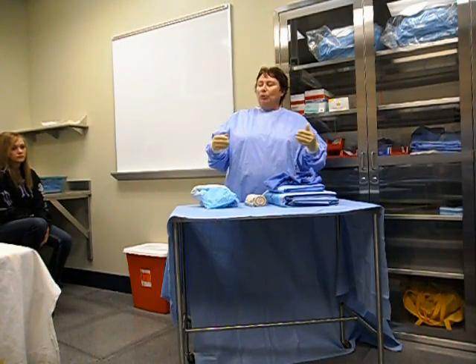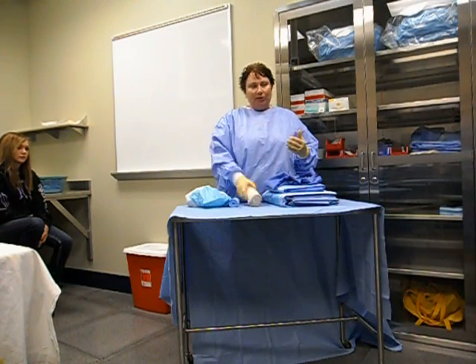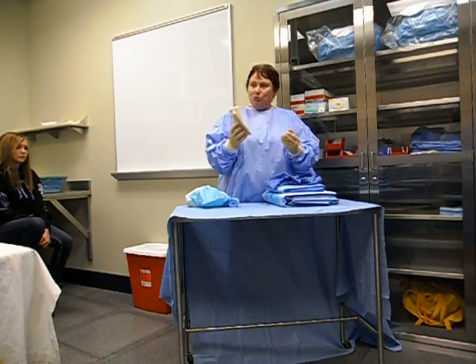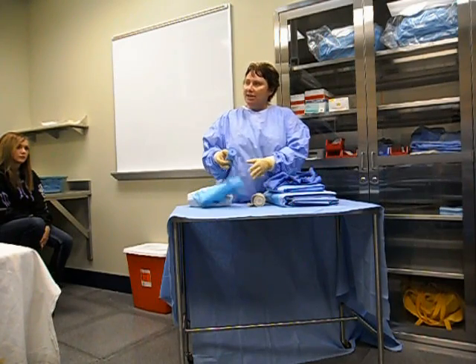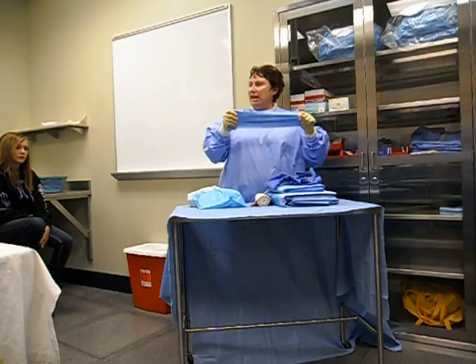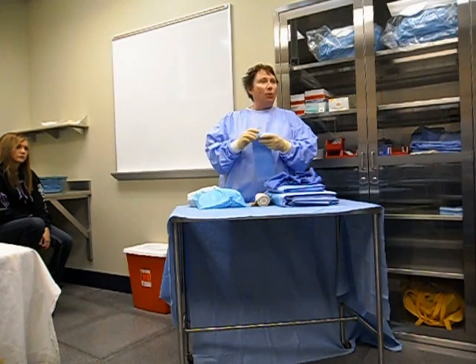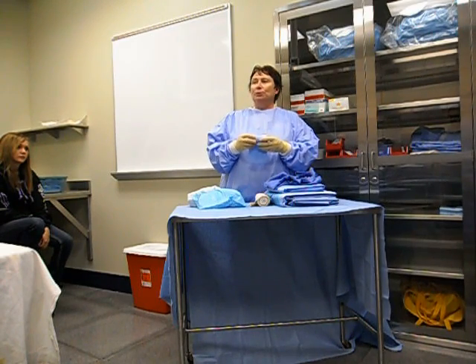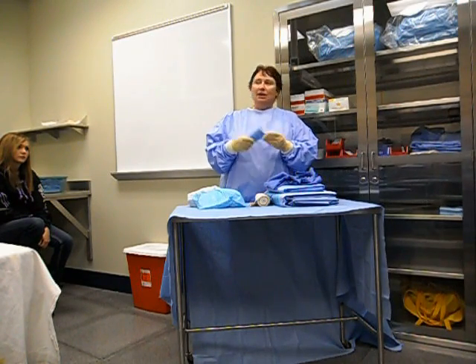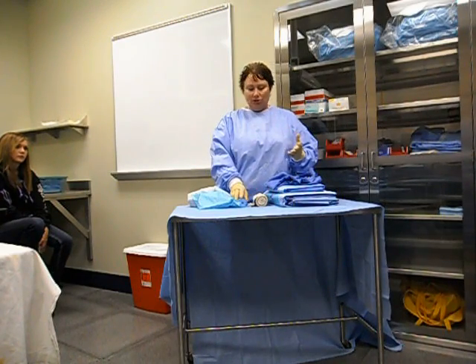Then we're going to wrap the impervious stockinette with either an Ace, which is real common, or an Esmarch. An Esmarch is sort of like a big rubber band — an ace bandage without the coating on it. One other thing some surgeons like is a Coban, but for the purposes of testing and practicing, either the Esmarch or the Ace is going to be easier for you to use.